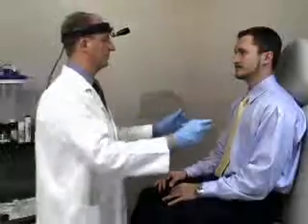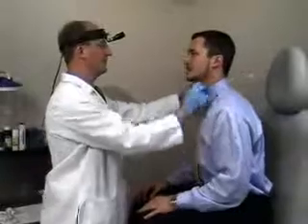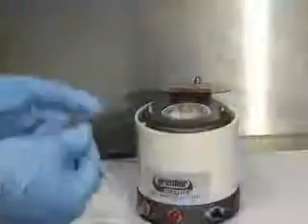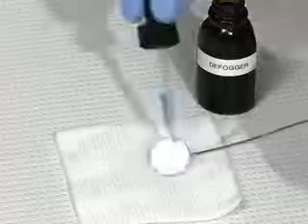The patient should be seated opposite the examiner. Ask the patient to uncross his or her legs and lean gently forward. Ask the patient then to open the mouth widely and protrude the tongue. Warm the mirror to just above body temperature or coat the mirror with an anti-fogging solution.